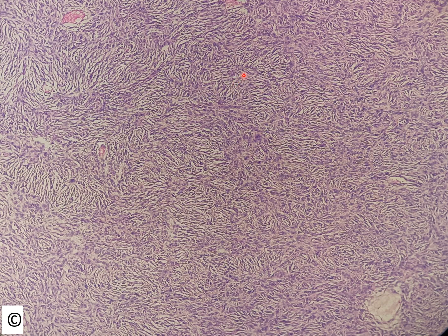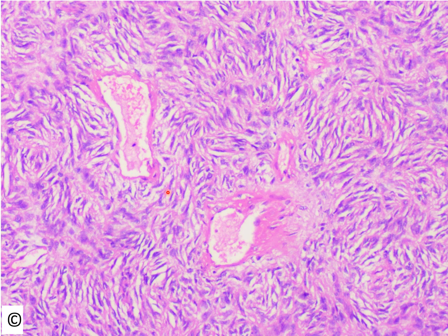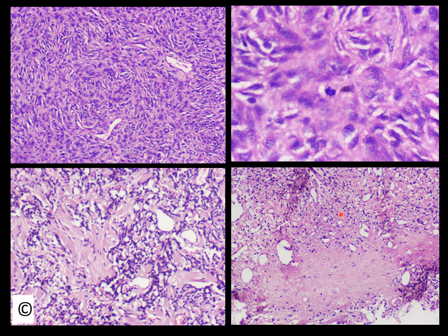Coming to the cellular arrangement, the pattern is haphazard or patternless pattern, and this pattern for the solitary fibrous tumor was first described in early 90s by Dr. Stout. You can see some foci have storiform pattern. Now coming to the blood vessels, these vessels are dilated and there is a thick band of collagen around the blood vessels. You can see this is sclerosis or hyalinized vessels, which is merging with the intervening stroma.